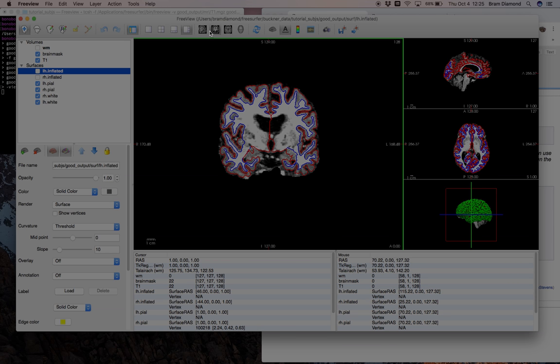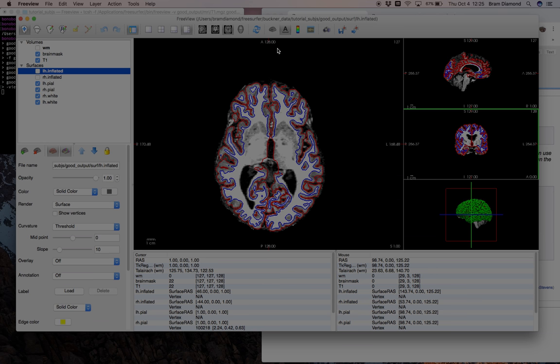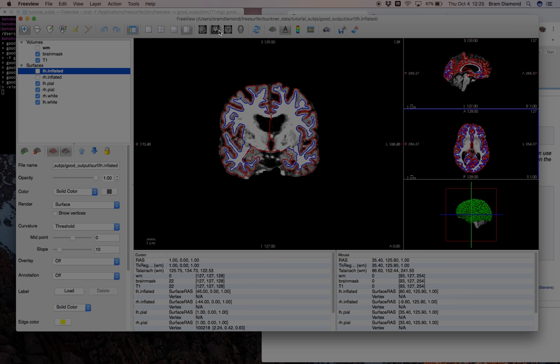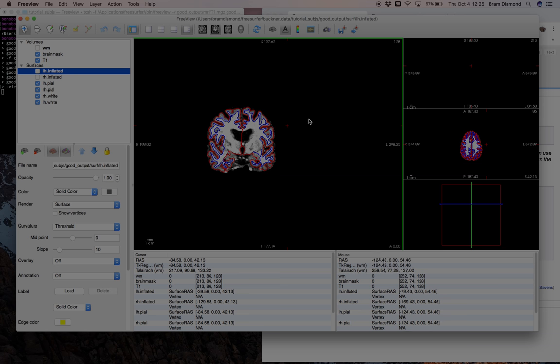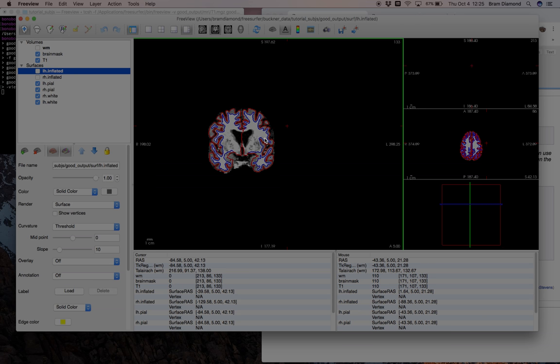You can also change the orientation — in this case, it would be changing the orientation of the predominant view, which is coronal. If we'd like to change it to axial, we could do that and the larger pane becomes axial. I'm going to keep it as coronal for now. If you've gone through the brain and want to return to the default view, you can press the reset button up here.